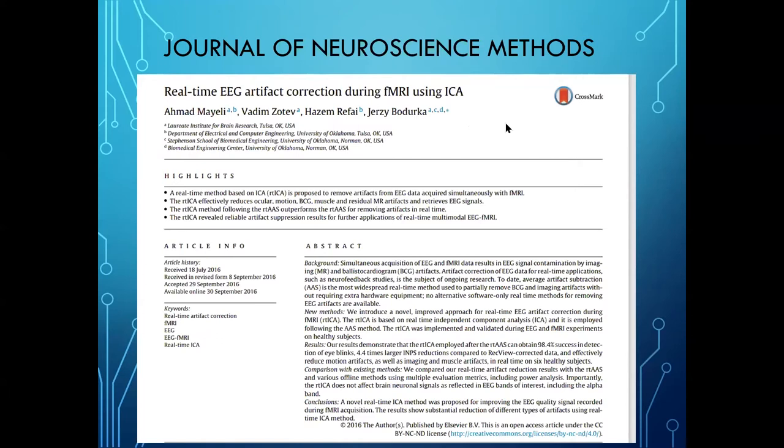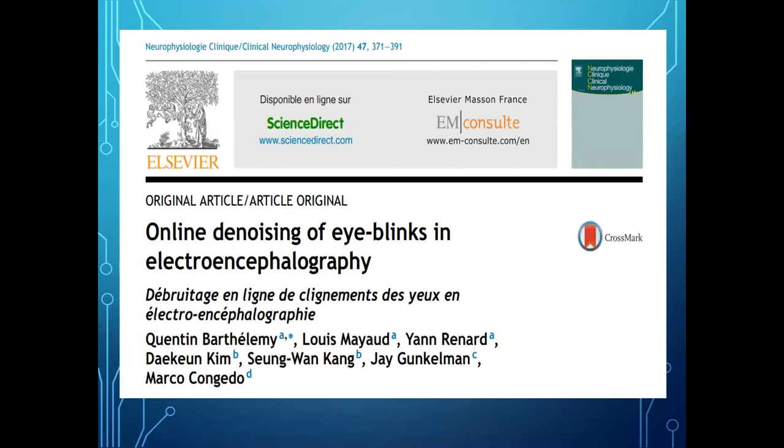Now, ICA is relatively newer. The older technique to cut out major artifacts was classic, and we have to splice the ends together. We use a Savitzky-Golay splice technique to minimize the artifact when you splice ends together that don't actually go together. Because when you make a cut in time, not all the ends merge nicely. And the Savitzky-Golay does a really good job, but it's not perfect. It induces a small amount of artifact. And if you have to do it, it's an acceptable artifact because that's the best way we can do it. But you don't always have to cut everything out. If you can extract something and eliminate cuts, you minimize the artifact induced by the Savitzky-Golay low pass.